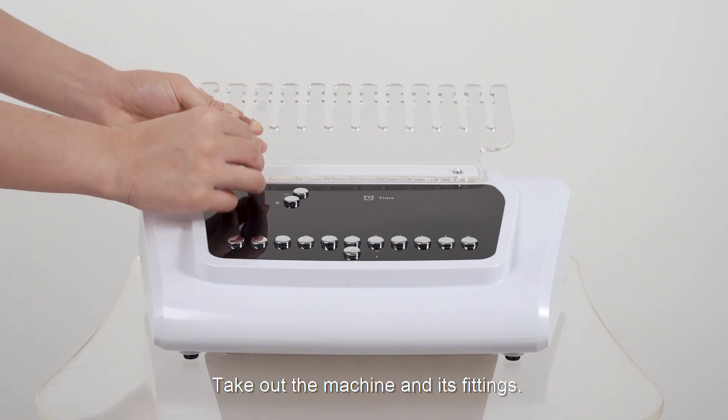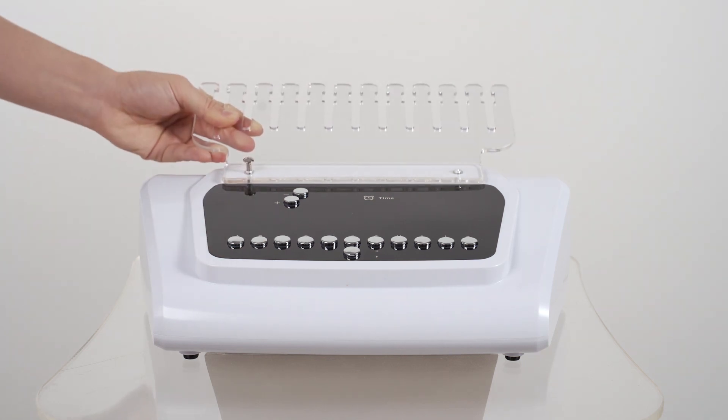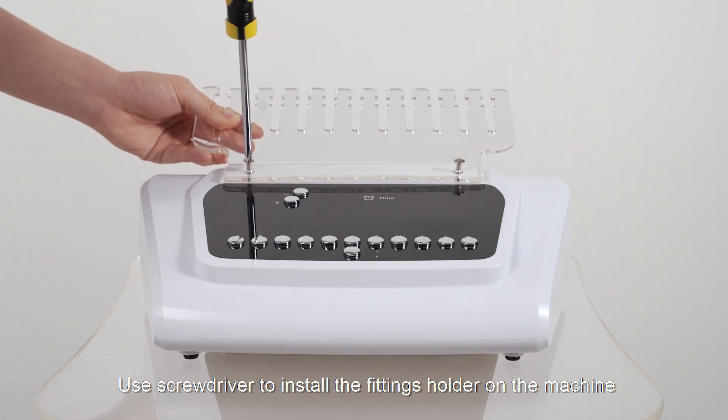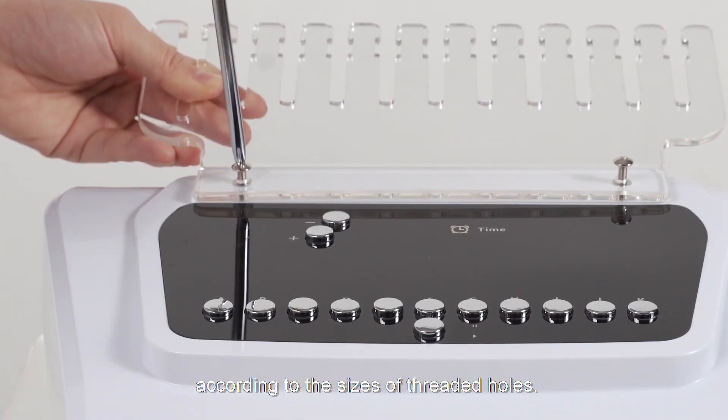Take out the machine and its fittings. Use a screwdriver to install the fittings holder on the machine according to the sizes of the threaded holes.